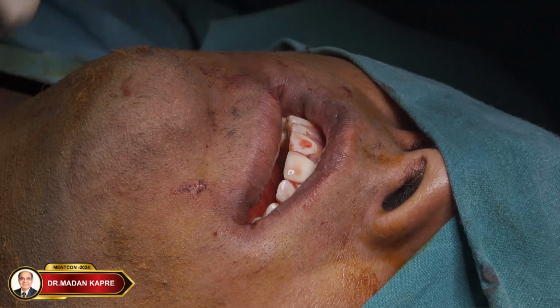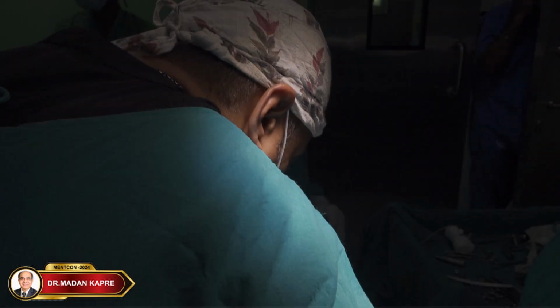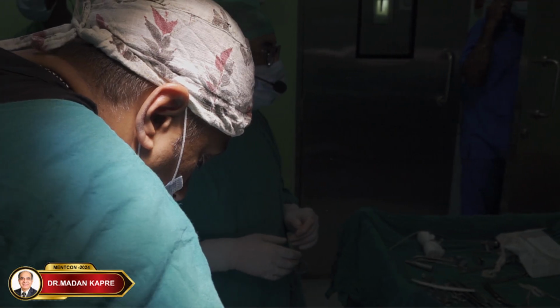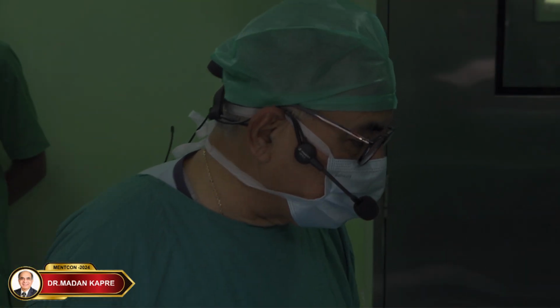Because if you dislocate the TM joint, then the problem comes of physiotherapy post-operatively. Then the patient has to be put on a barrel bandage and then it is completely lost. You have lost the game. So you ensure that you don't dislocate it. You only stretch so far that the joint is not dislocated, because if you dislocate the joint, there is a problem post-operatively.